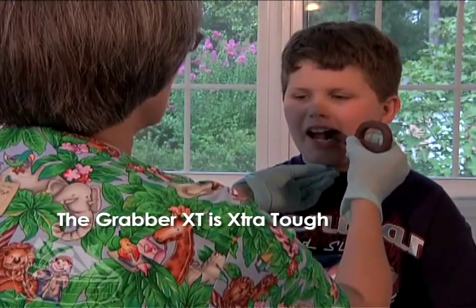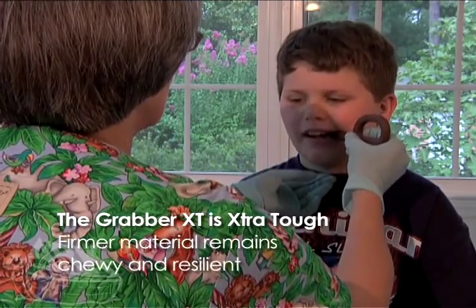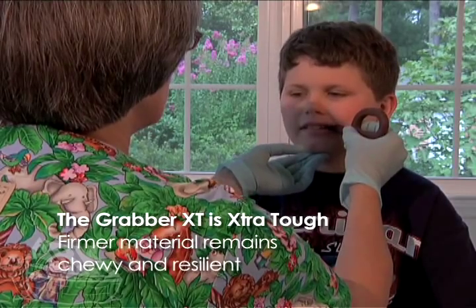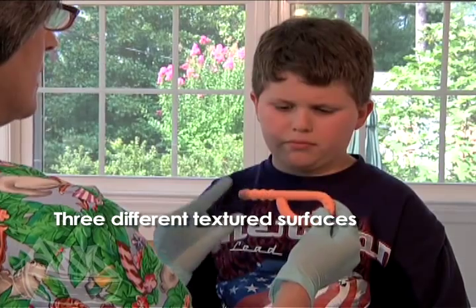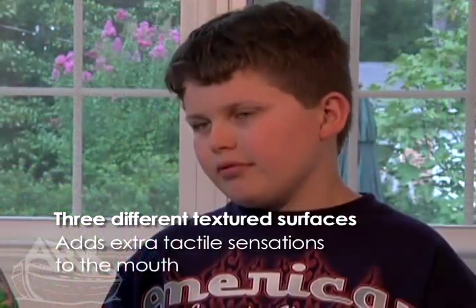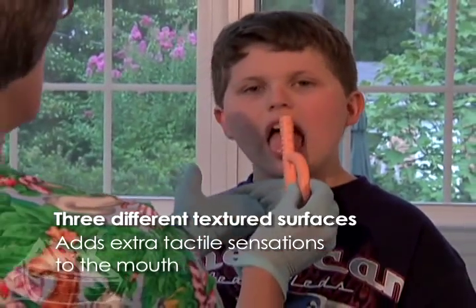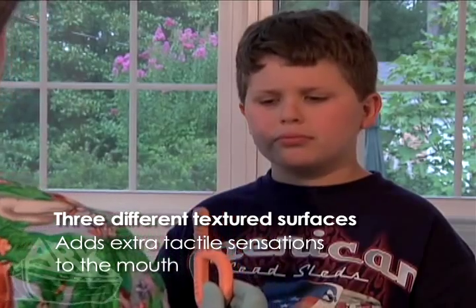ARX Grabber comes in a variety of versions. The Grabber XT is extra tough, constructed of firmer material but remains chewy and resilient. The textured grabber and the textured grabber XT are designed with three different surfaces. Each surface serves to add extra tactile sensations to the lips, cheeks, gums, and tongue.